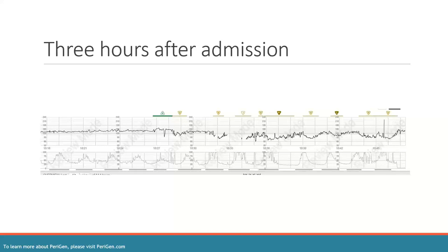Doctors at bedside, outcomes: patient pushed for an additional 15 minutes, strip did not improve, patient delivered a baby girl at 11:07 who was 8:10. Apgars were 9 and 9, no cord blood gases were obtained.